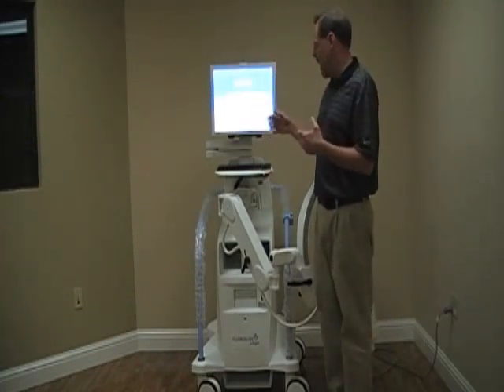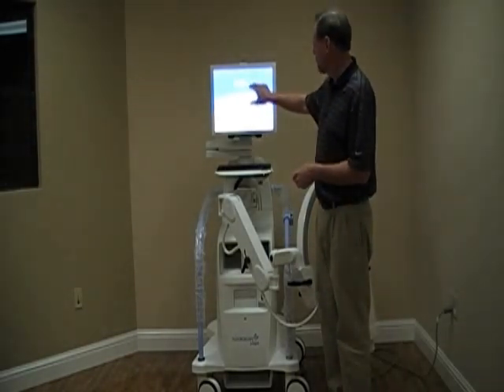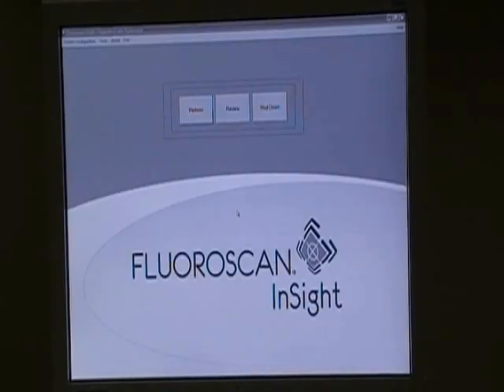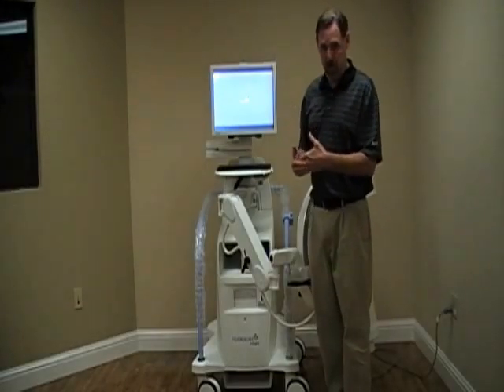Shutdown is exactly that. The on button is the switch on the front; the off button is the Shutdown button. When the system screen turns off, we can then unplug the machine from the wall.